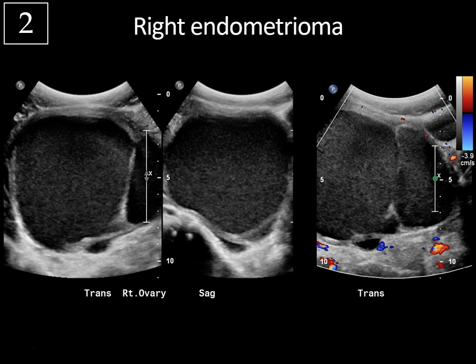Just a few mimics to be aware of. Sometimes mucinous tumors of the ovary, such as a borderline epithelial tumor — which is a low-grade neoplasm — can have echoes in it, but those tend to be scattered low-level echoes as opposed to homogeneous and diffuse echoes. Also, fluid-dominant teratomas can sometimes mimic endometriomas. And if there's ever a question, MRI may be obtained because that modality has very high specificity in the diagnosis of endometriosis.